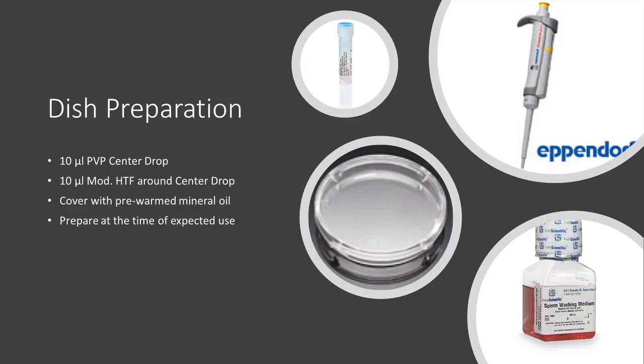And some people will do ICSI in a bicarbonate buffered media. I personally do not do this, but would caution that if doing ICSI in bicarb media, pH now becomes a concern. With this said, a lot of oil needs to be pre-equilibrated ahead of time, and do not do more than 4 to 5 oocytes per dish, as the pH starts to shift after about 5 minutes and could possibly damage the resulting embryos.